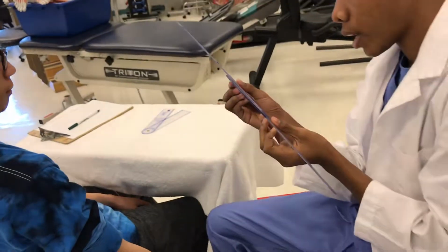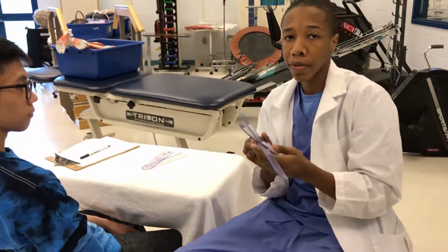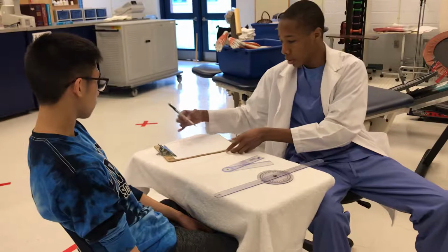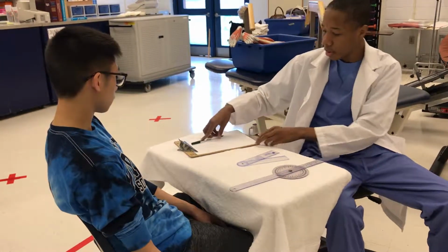So the patient had about 5 degrees elbow extension, and the normal would be 0, so the patient is about normal, a little bit under. I will record it on the paper.